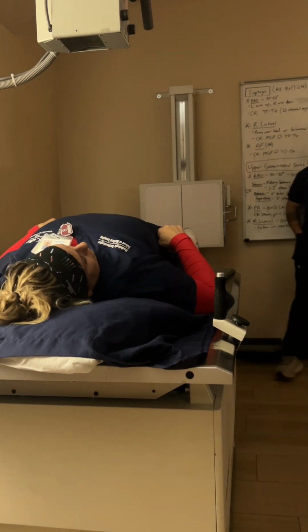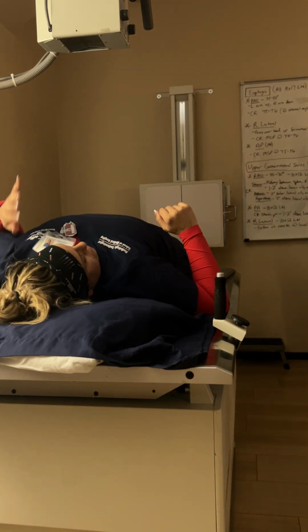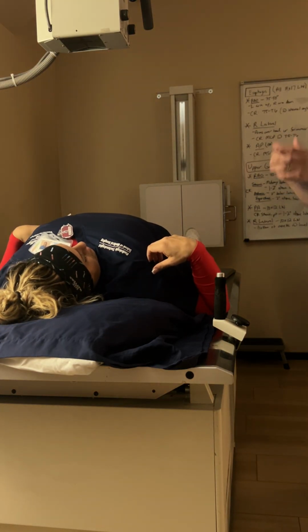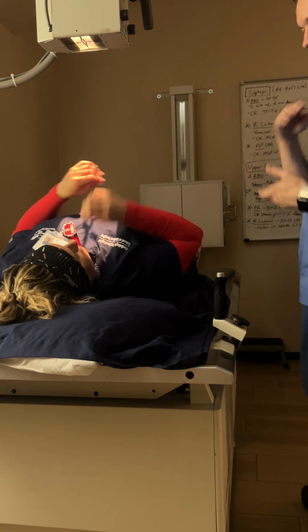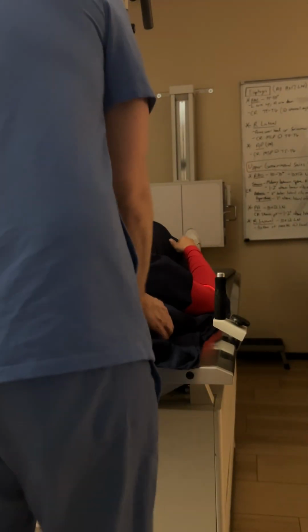For the esophagus, it really doesn't matter as much as it does for the stomach what order you do them in, because with the stomach, you really do have to be careful that you don't obscure things by giving them too much barium and turning them in the wrong position first. But for the esophagus, you're not waiting for anything to fill or empty. We're just looking from here to here. Want that tube to be full of contrast.